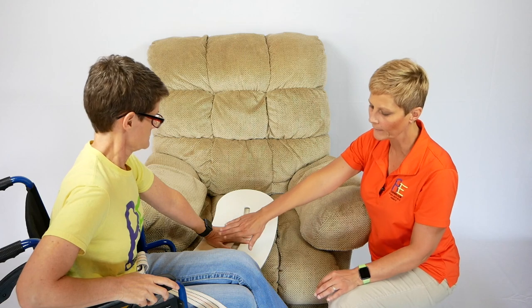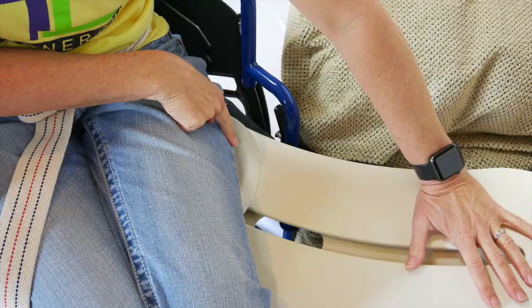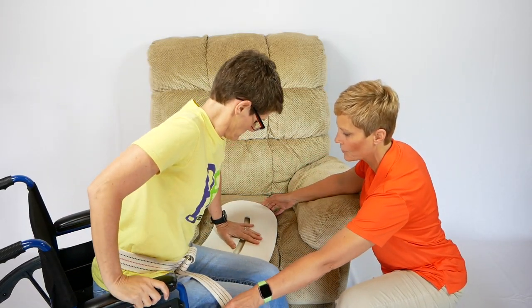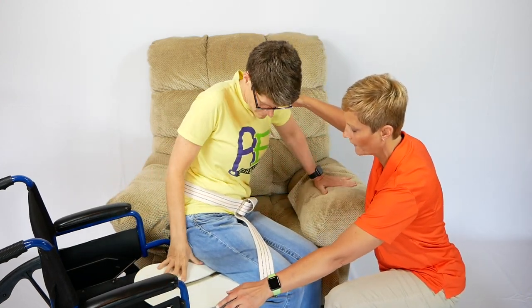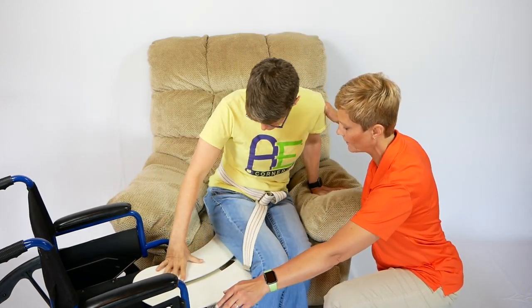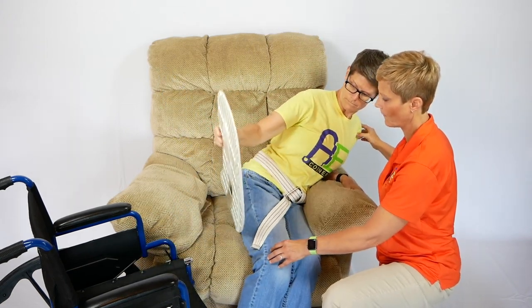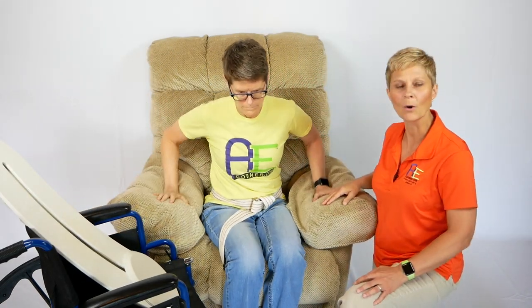She's going to put her buttock on the disc, letting the front edge of the disc still show, so that she starts to glide across the board. She's using her hands to start gliding across the board. As she comes across, the disc turns a little bit and she comes into the recliner. There you go — and she's sliding the board out from underneath her.